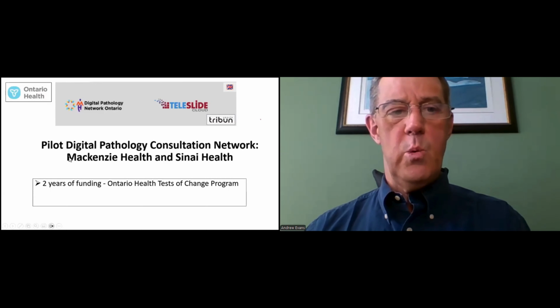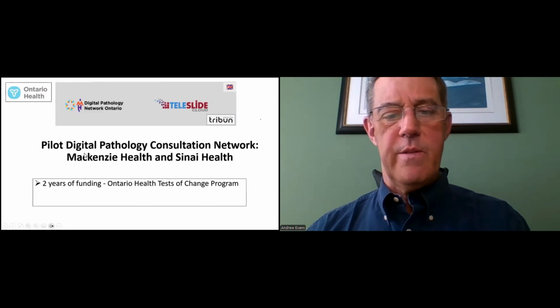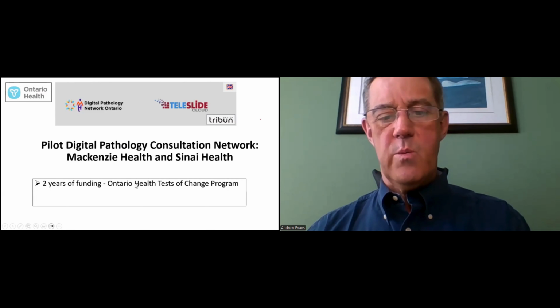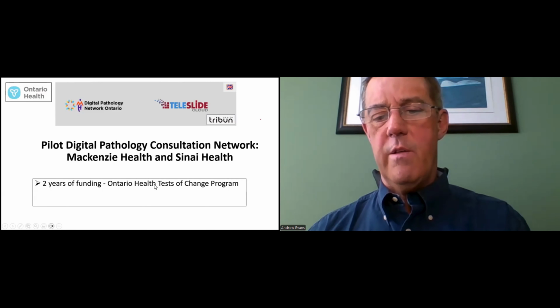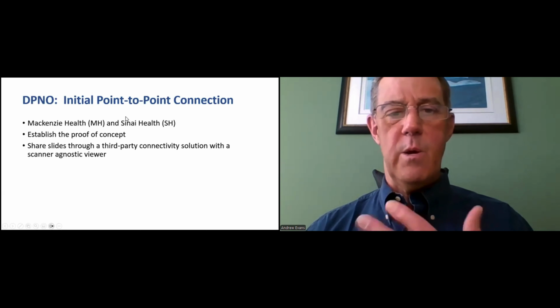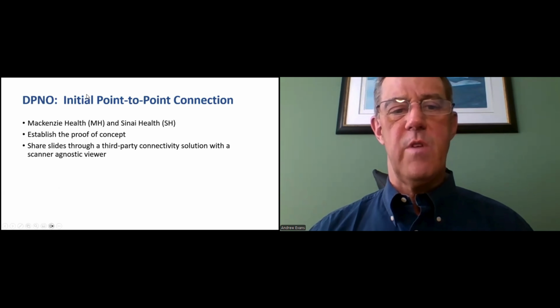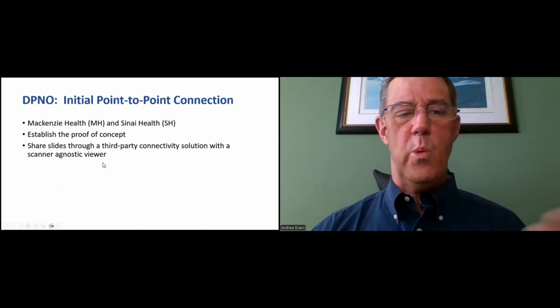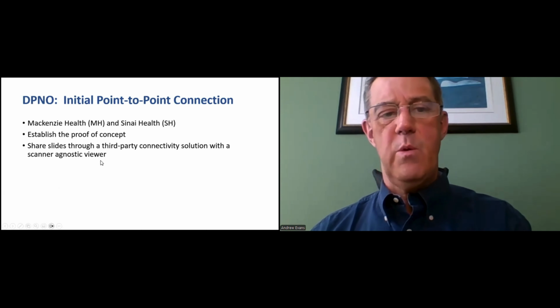Now we move to the collaboration that we had with Mount Sinai Hospital. So this was 2 years of funding given as a result through the Ontario Health Tests of Change program. And the idea was to establish a proof of concept for a point-to-point connection, sharing slides through a third-party connectivity solution with a scanner-agnostic viewer.